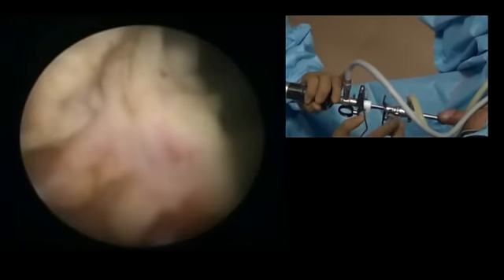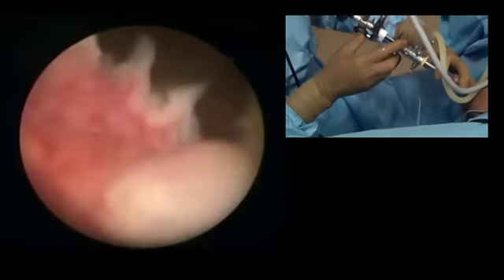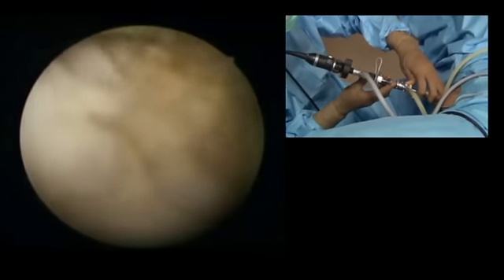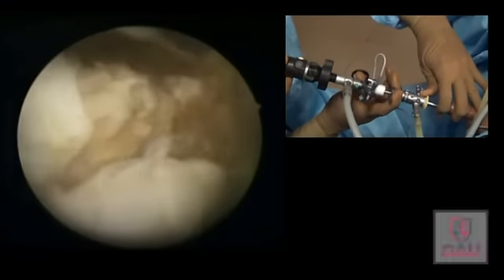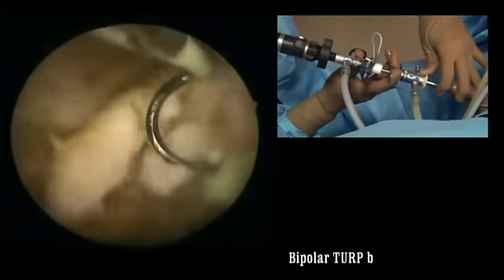Come back, and this is the level of the resection. You can clean a little bit more on the right side — some tissue there. You have to actually cut in a manner that you create a fossa effect.